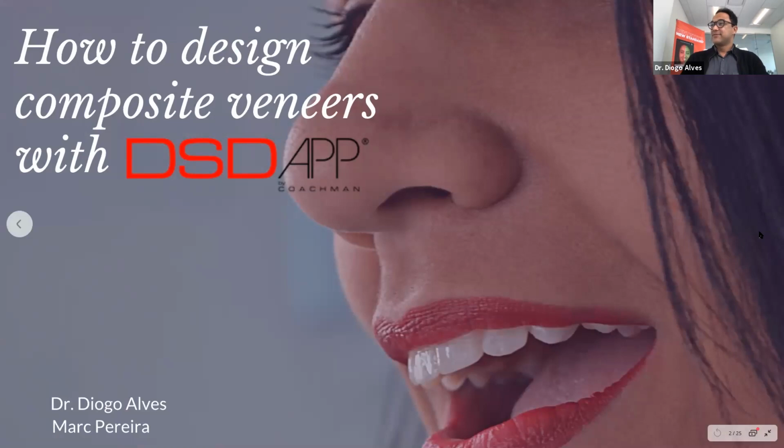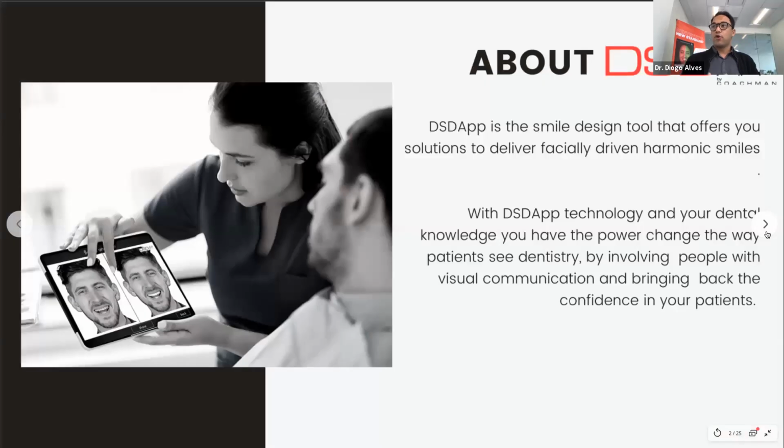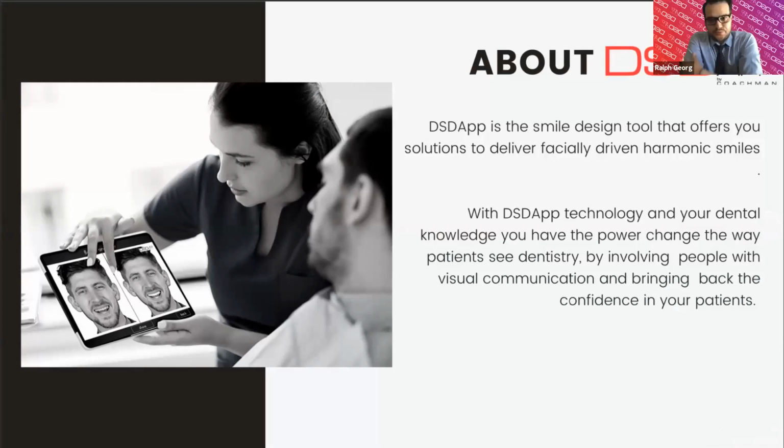Awesome. All right. So just for those who still don't know what the Digital Smile Design and the Digital Smile Design app is, Mark, can you give us a little bit? Sure. So DSDAPP was founded in 2017, and it was the brainchild of Dr. Christian Coachman and our CEO and founder, Ralph George.